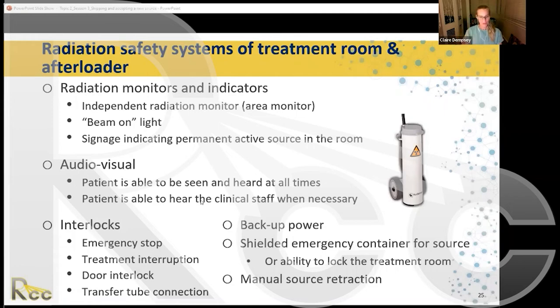Every day we were calling, going, where's our source? What's happening with our source? Why is our source still there? The issue was there were no flights. There was no flight from Dubai to Australia. Everything was shut down. So it took 2 weeks for our source to come from Dubai to Australia before we could install it. So obviously, yes, the source is decaying at that point.